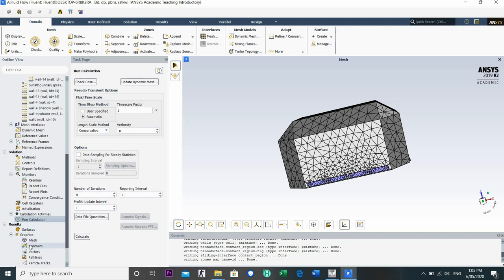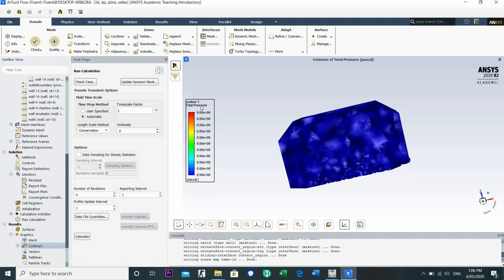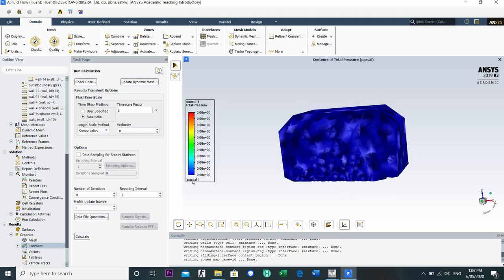We can check it with the contours first, with the pressure, static pressure, but total pressure in the interior incubator. As you can see here, total pressure is all 0. It's already filled. This is gauge pressure, total pressure in gauge, so it's 1 atm inside. Then we are going to run the calculation for 1000 iterations.